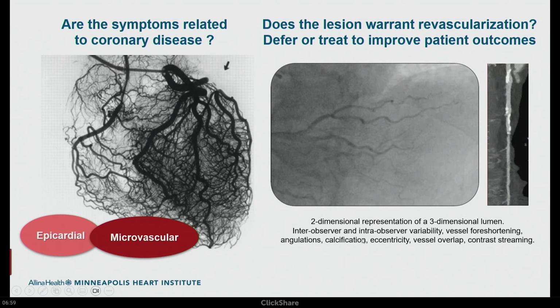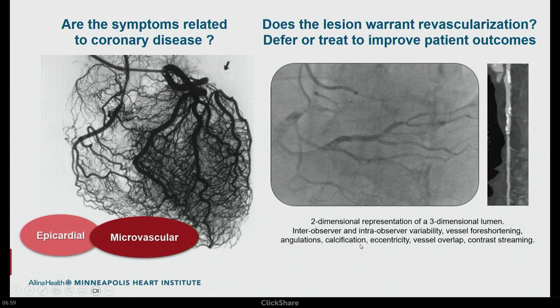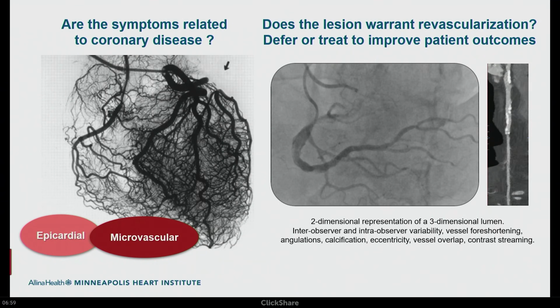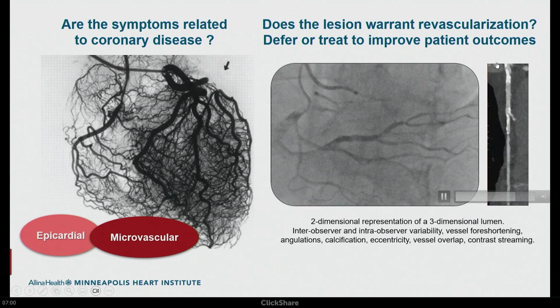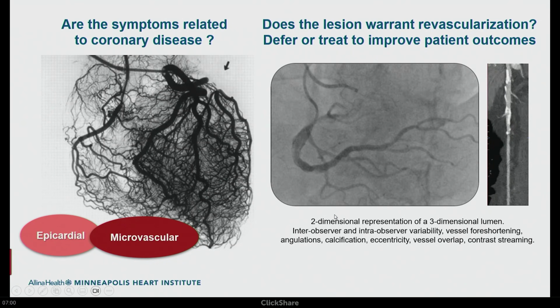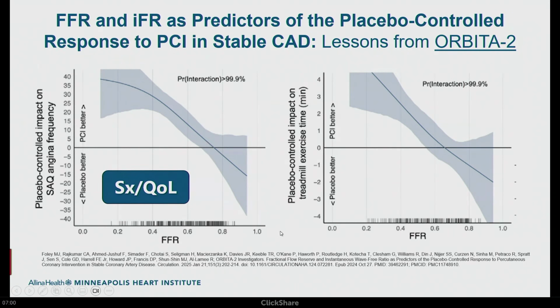We'll use things like coronary angiography and even CT, but there are tools that many of us perceive as the gold standard, like the invasive coronary angiogram, that, as you can see here below, have a whole array of limitations: a two-dimensional representation of a three-dimensional volume. I look at a lesion and I call it 40%, my colleague calls it 60%. Calcium, we don't opacify the vessel sufficiently. Even from CT, as you show here in a straight multiplanar reconstruction on the right, is this lesion ischemic or not? There are a number of limitations from anatomy alone, and that's the reason why physiology is relevant, because we're trying to understand how to diagnose a problem and how to better target therapies.